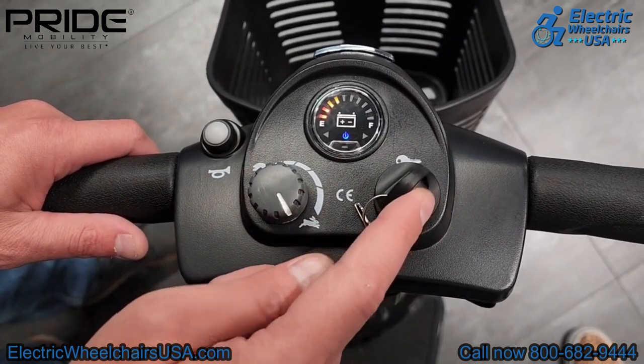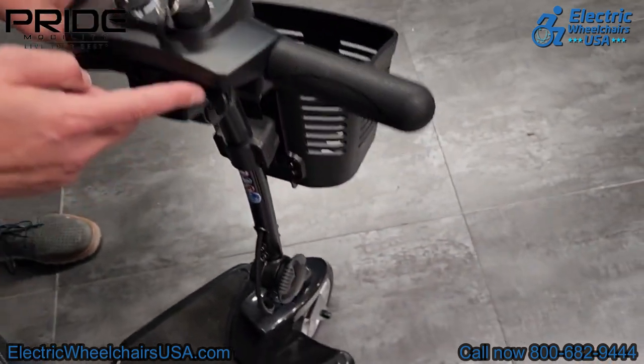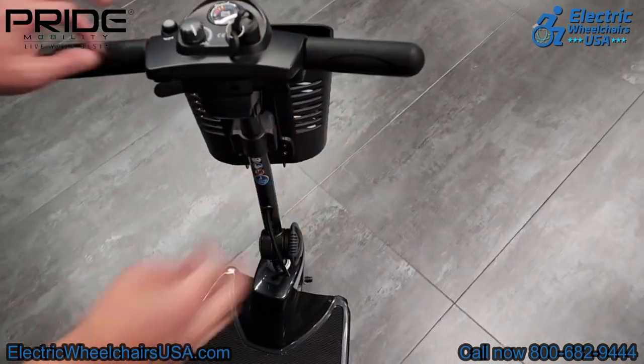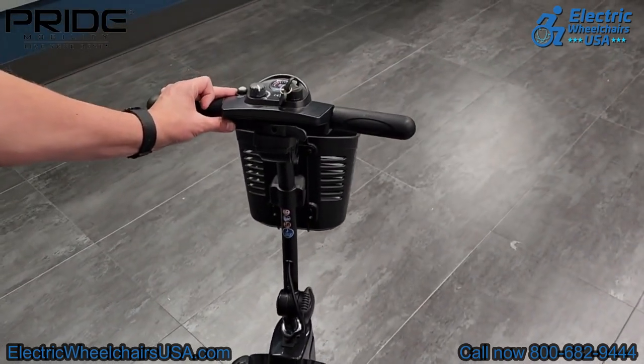This is where your key goes, and there is a horn on the left side as well. The tiller is ambidextrous, so you can accelerate forward or go in reverse with just one hand. If you have limited mobility in one hand, you can operate the scooter with just one hand.